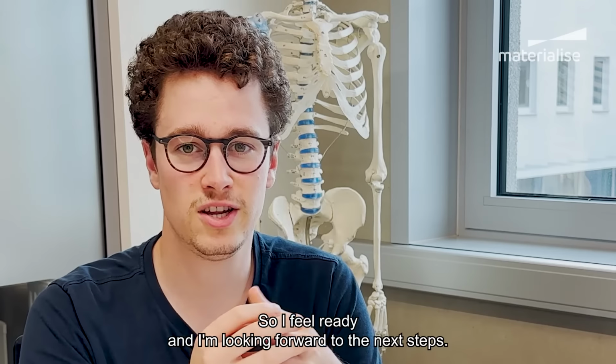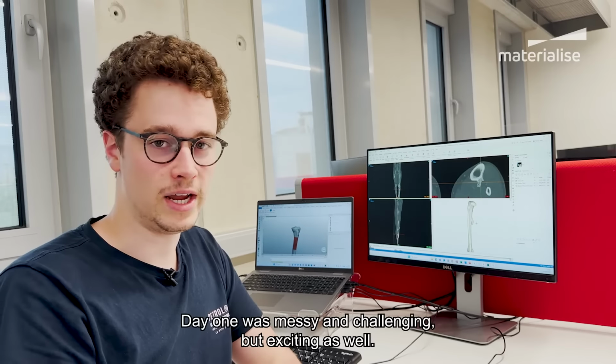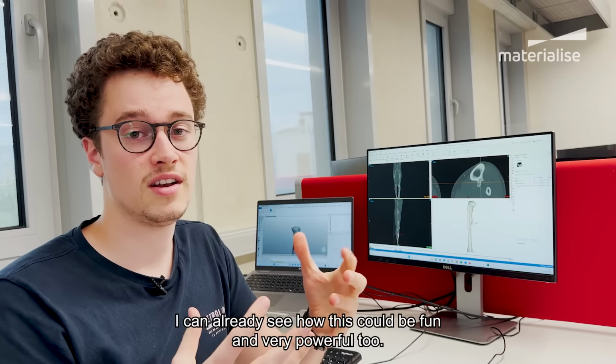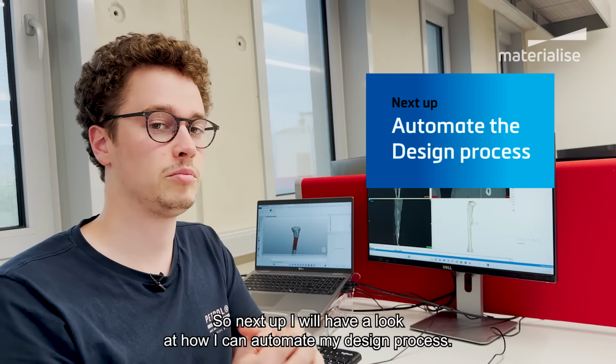So I feel ready and I'm looking forward to the next steps. Day 1 was messy and challenging, but exciting as well. I can already see how this could be fun and very powerful too. So next up, I will have a look at how I can automate my design process.